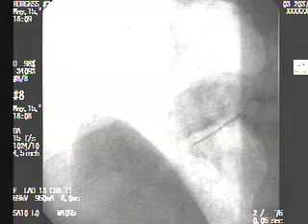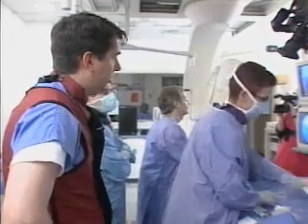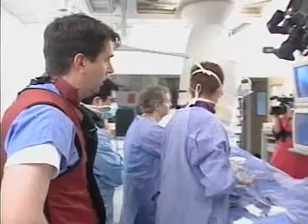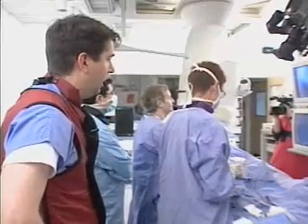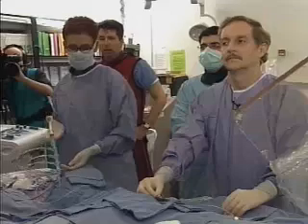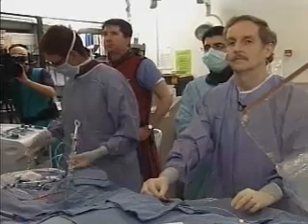I think what people need to realize, Tim, is that when we say the numbers that Dr. Campbell shouted out here, 12, 16, 18 atmospheres of pressure, that's about 5 to 10 times the pressure in your car tires. And we saw that it took fairly high pressure before that waist went away, because there's a fair amount of calcium in that artery. So these are high pressures, and that stent gets pushed into the artery wall and really becomes part of the wall.